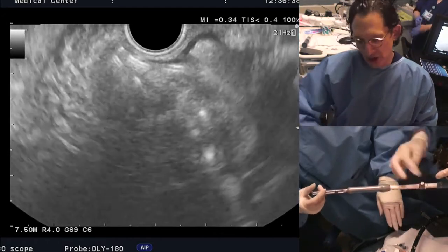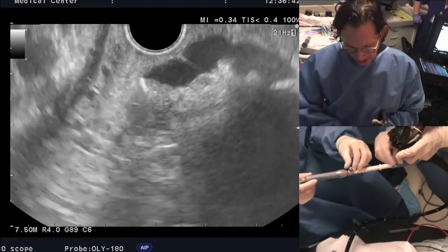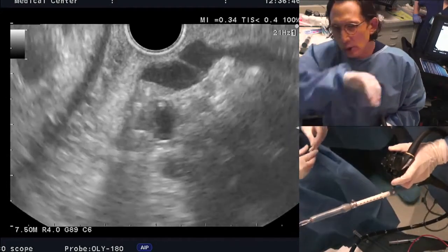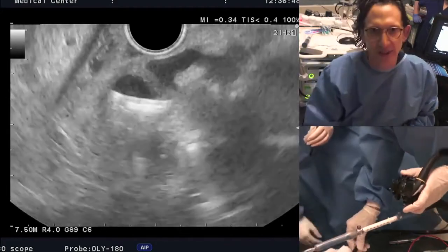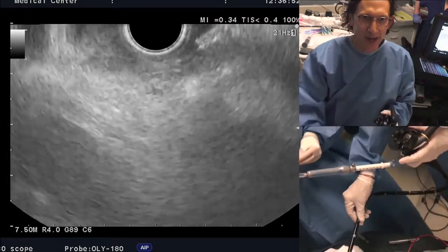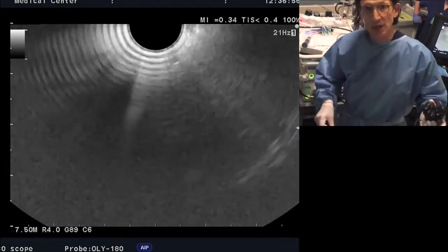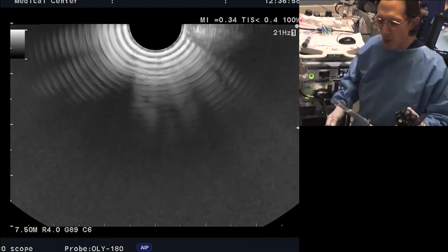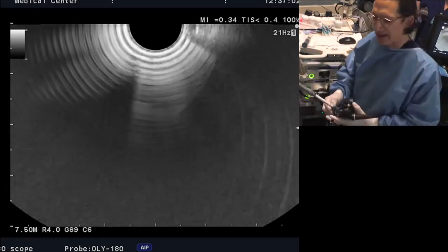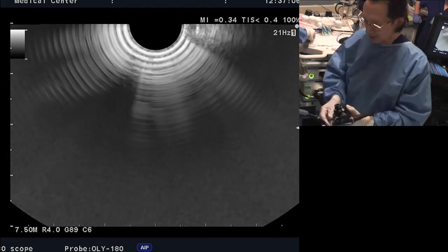Now I advance the sheath forward as a precaution, just to make sure that I don't have a risk of contaminating my needle. Now, the glue's all in the varices. I don't think it's spilling out into the esophageal lumen or the stomach lumen. I'm going to pull out now. I'm not pulling this through the working channel because these scopes are expensive. So we don't want to take any risk, even though I think it is negligible, that we could spill glue into the working channel.